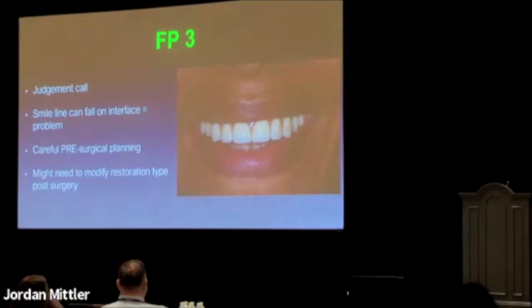Sometimes we extract some teeth, we get more resorption than we planned, or we find that the plane is different. So we always go to PMMA before we go to final restoration. Because PMMA is very easy to modify, very easy to add and subtract, to figure out where we need to be. And we can take a little denture repair acrylic and paint it on and see what it looks like. That's really easy to do. We don't have to do that once we've gotten all of it.